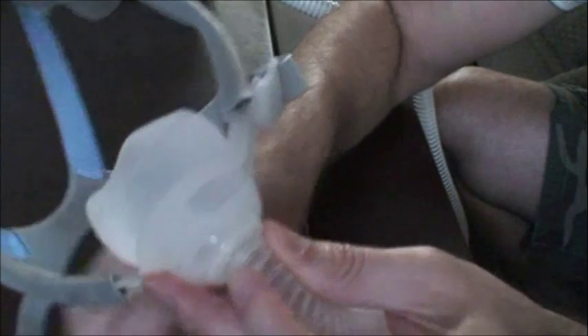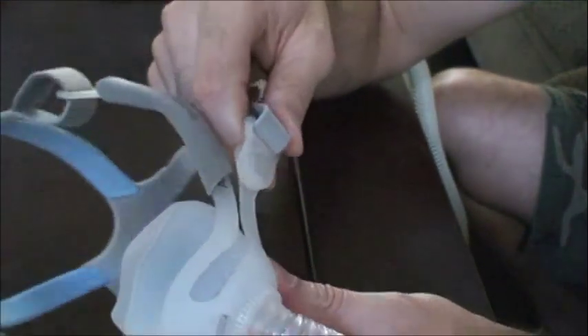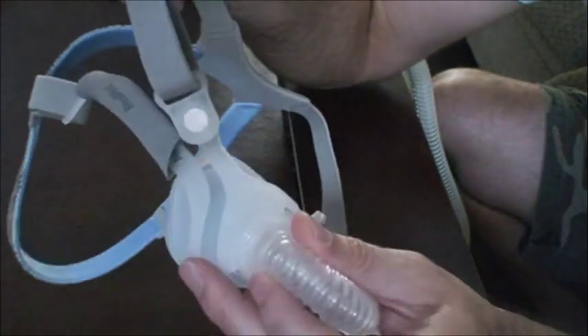My absolute favorite thing about this mask is the headgear. Overall it's fairly standard — I think it's a bit weird that you have the gray on the outside and the cool blue on the inside. But what's cool about this is they have clips. I love clips because it just makes it easier to get on and off.